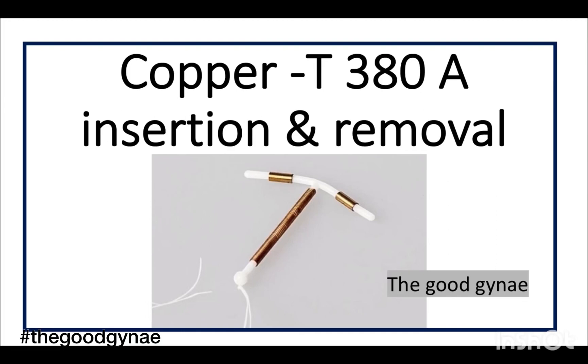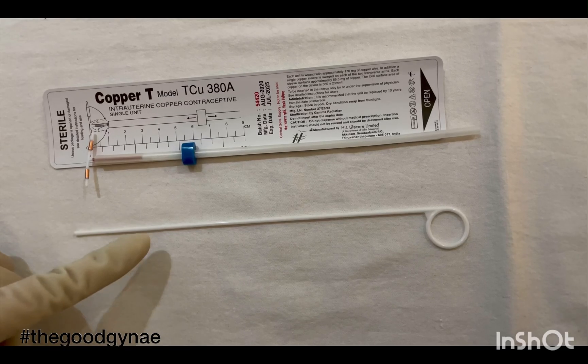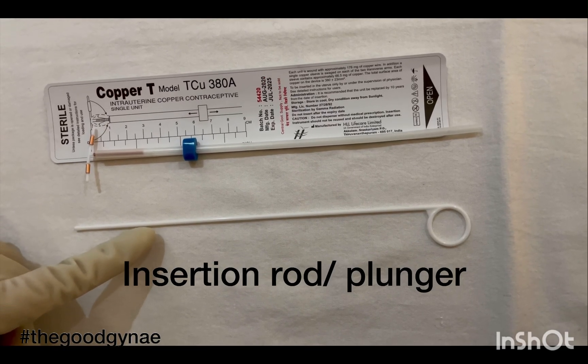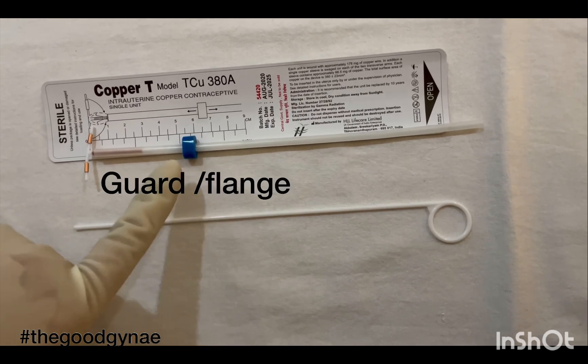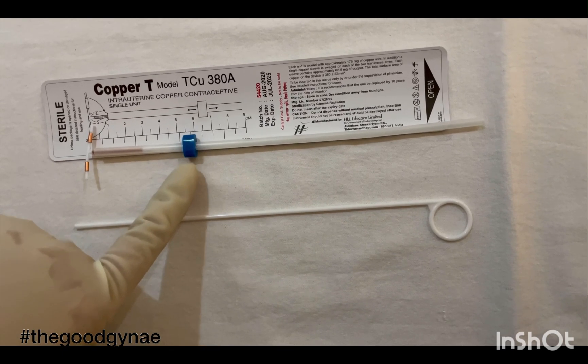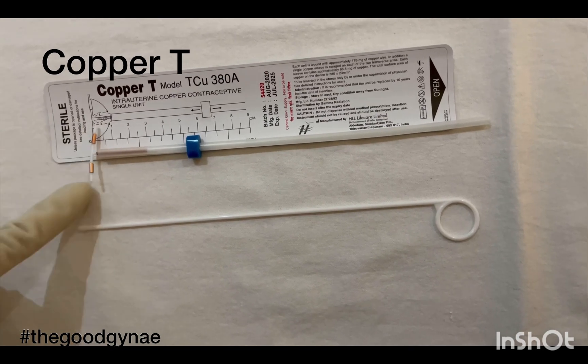Today we are going to learn how to insert and remove a copper T 380A. Let's understand what are the various parts of the copper T and what all comes in a packet. It contains an insertion rod or plunger, an insertion tube on which there is a guard. The copper T is inside this insertion tube; a copper T has two arms and a stem.